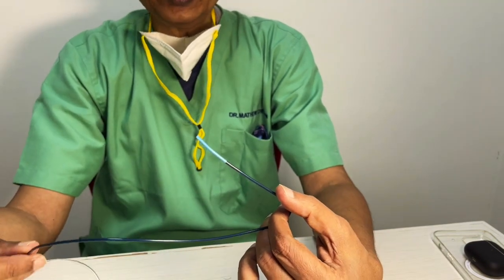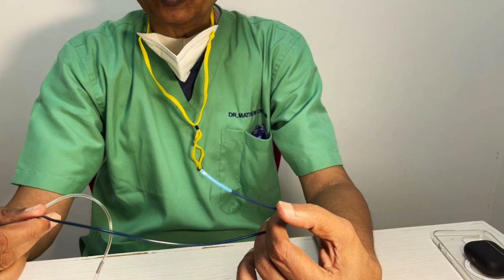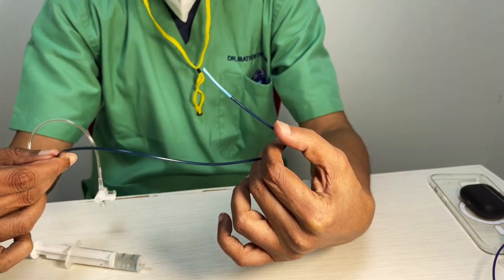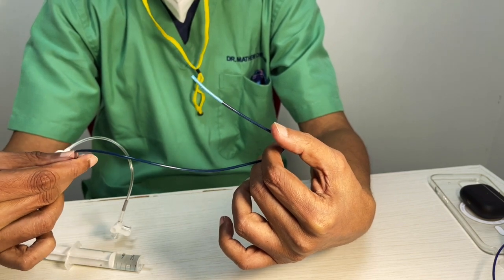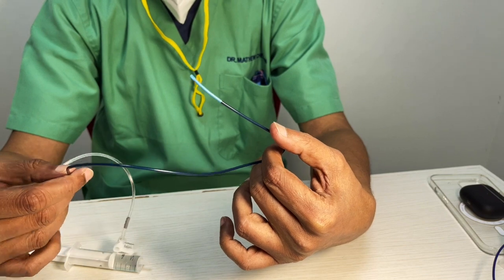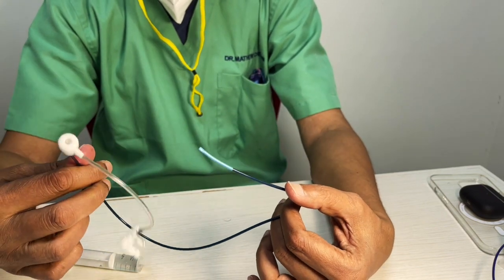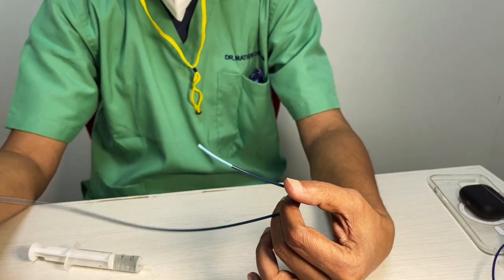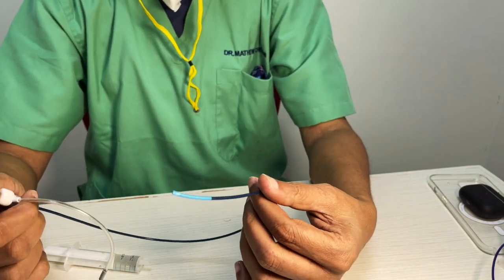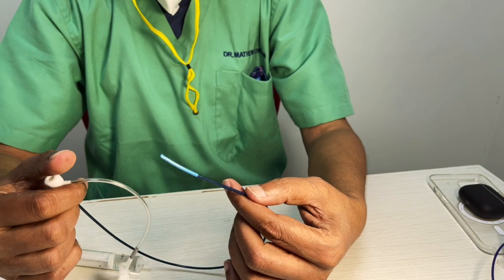So the only advantage, if you ask me, of the Cook sheath is that it is cheap. Other than that, the disadvantages are many, especially if you go into the internal carotid, you can dissect, and of course, it has a very tight valve, making it difficult to take it. Having said that, we still use it a lot in our department, primarily because we realize keeping it in the distal common carotid, we can do a great job.